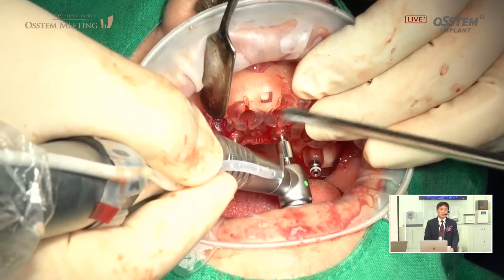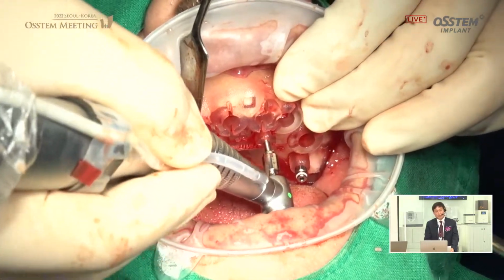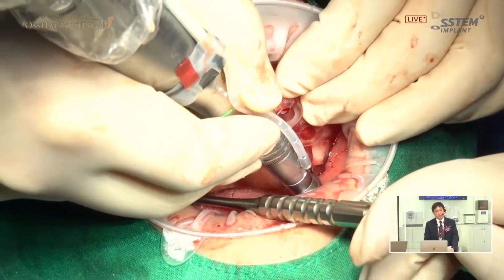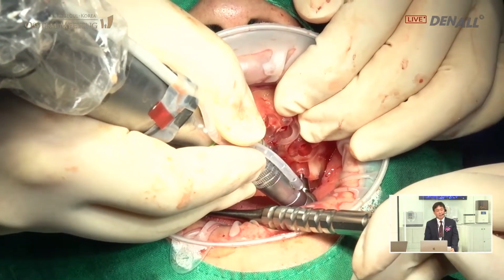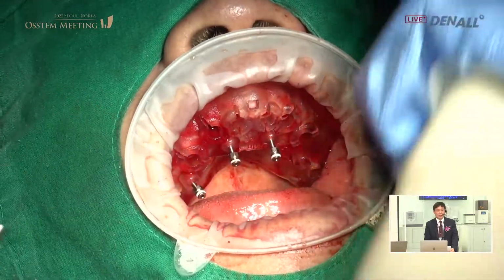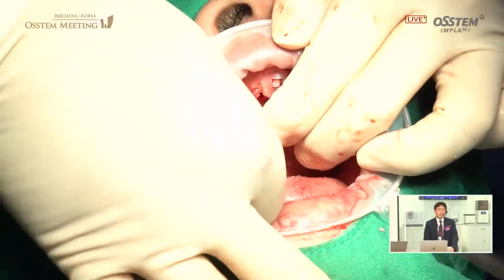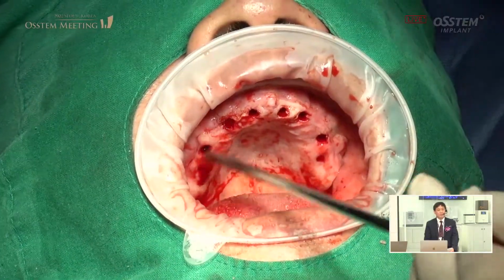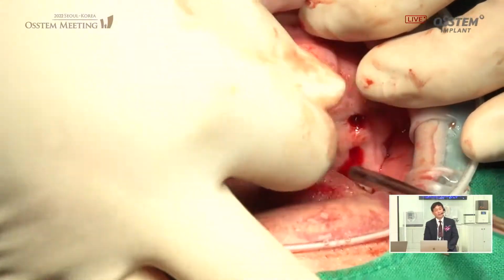Anchor screw is being removed. Surgery is being proceeded very quickly. Implants are all placed. It has taken about 40 minutes. It's remarkable speed. Can you say ah? Anchor screw is being removed. The fact that the anchor screw is being removed very easily means the bone quality is not very good. In the upper, implants have been placed, all 6 of them.